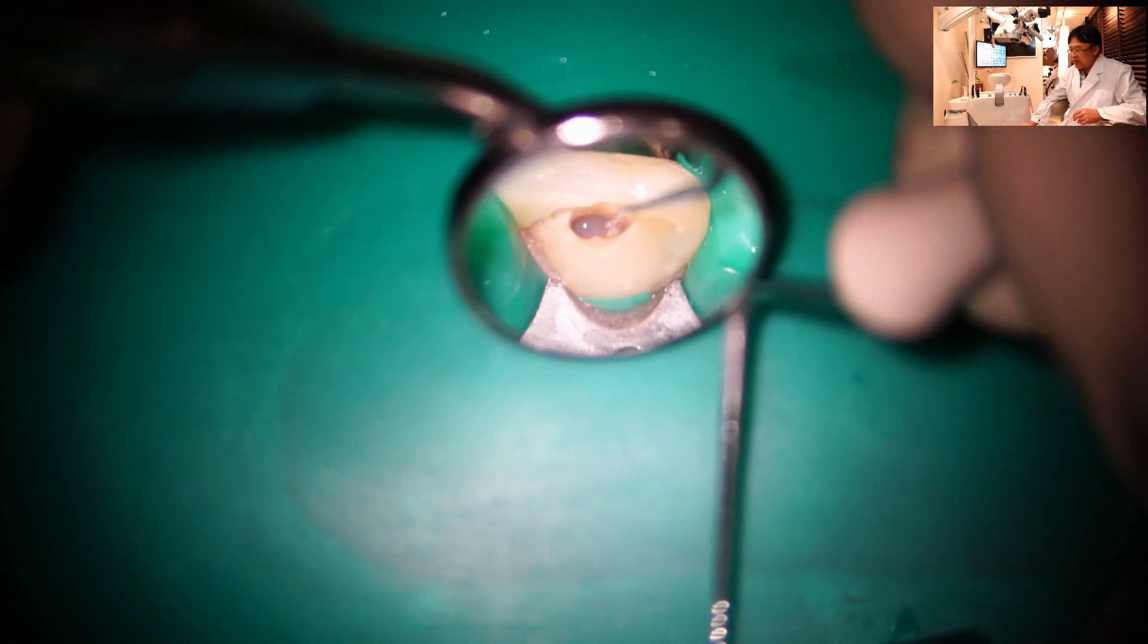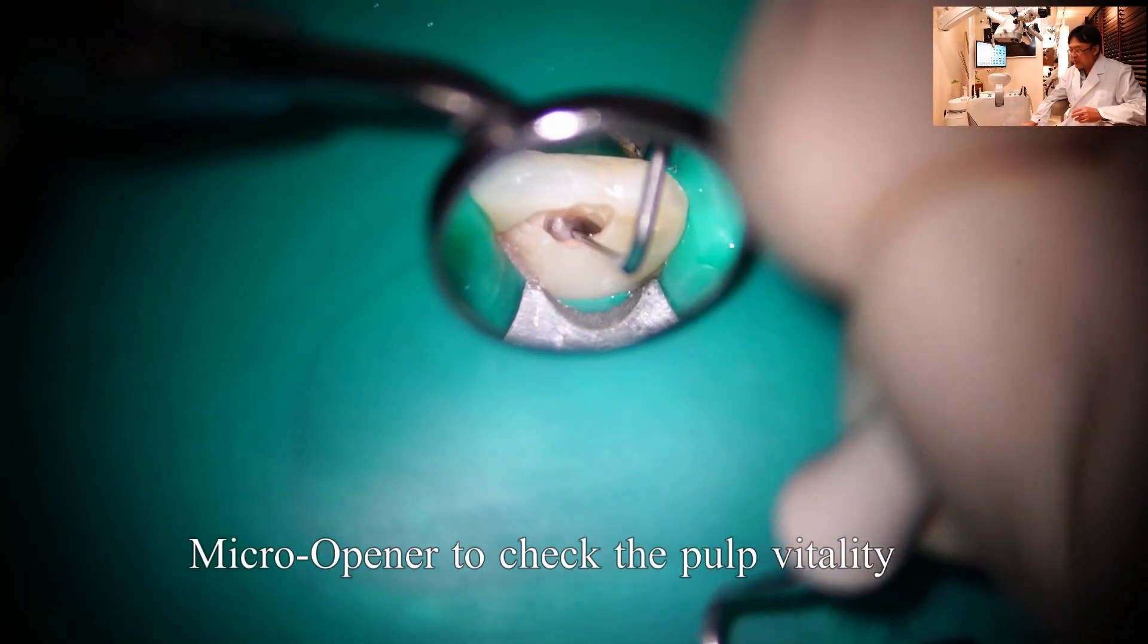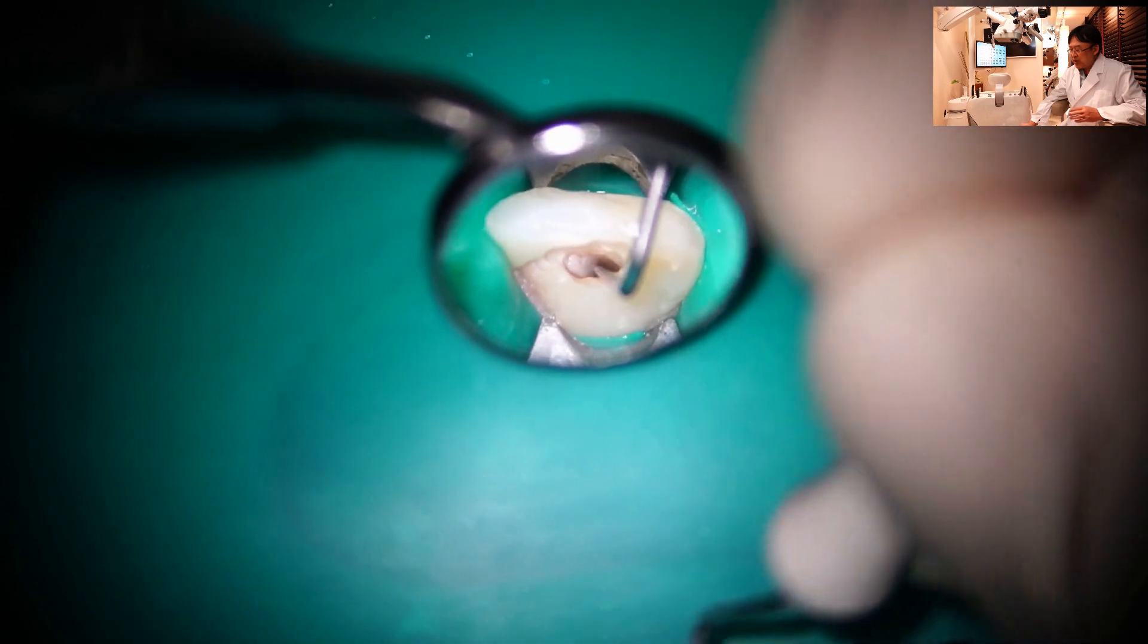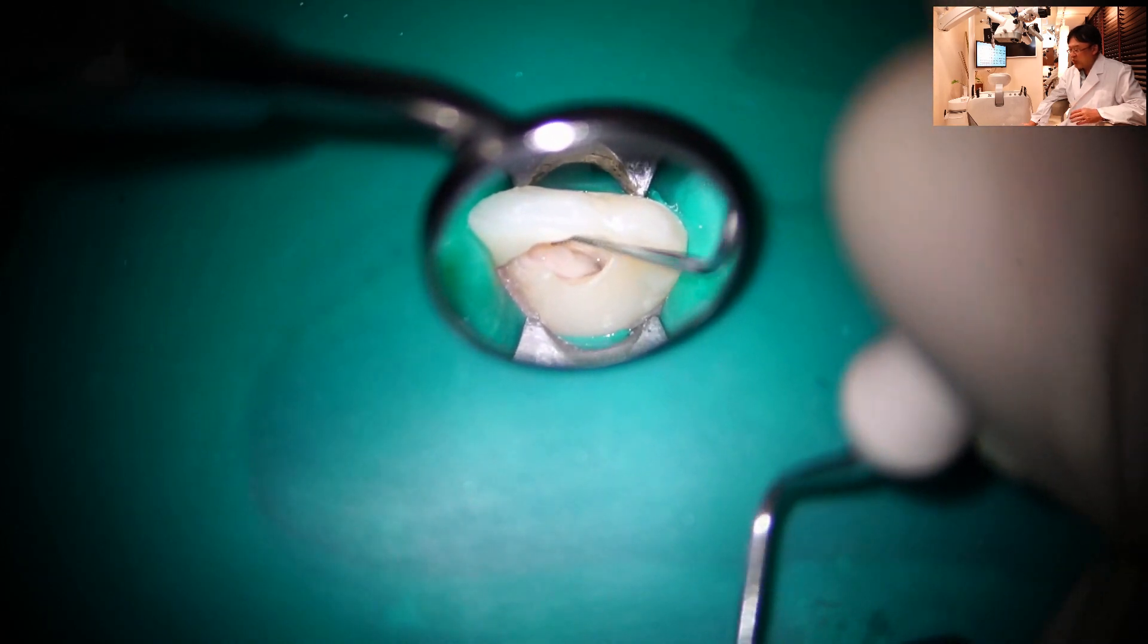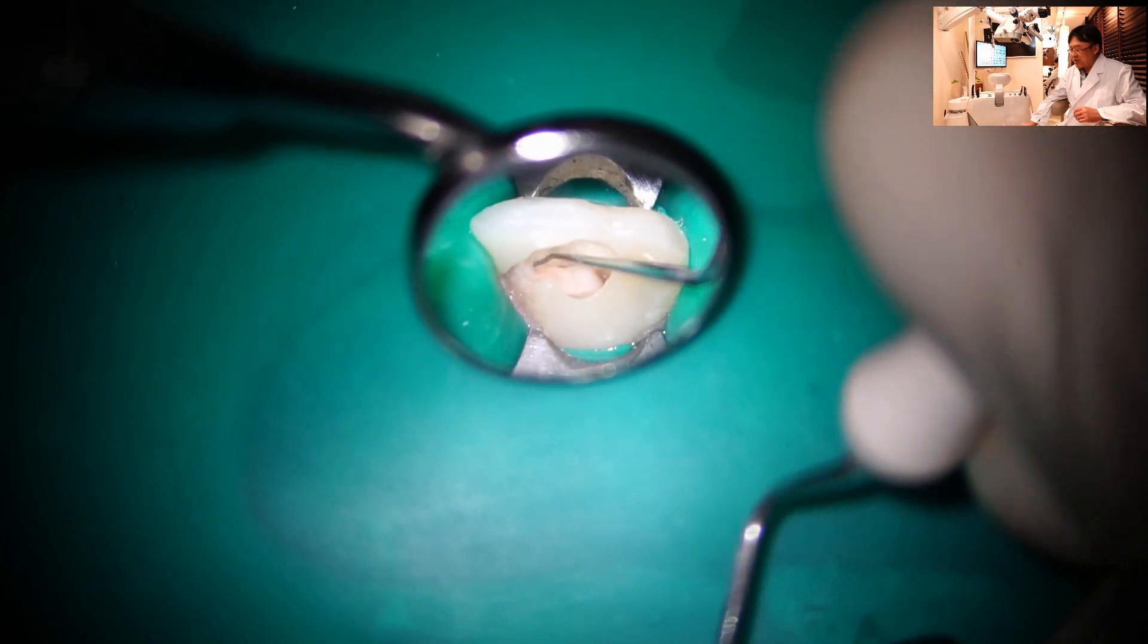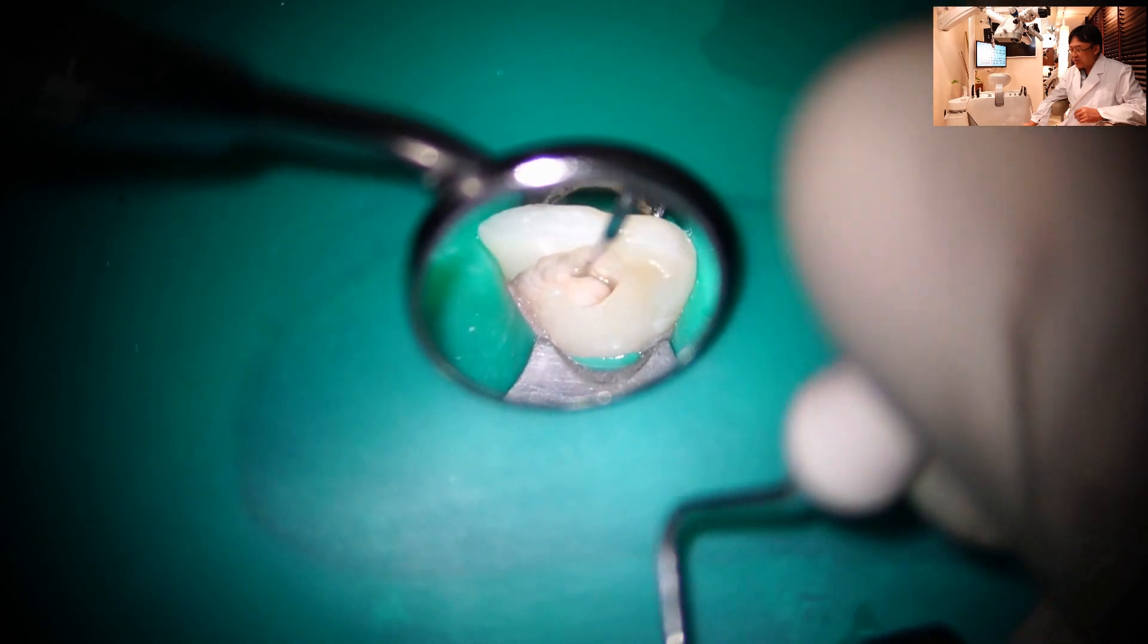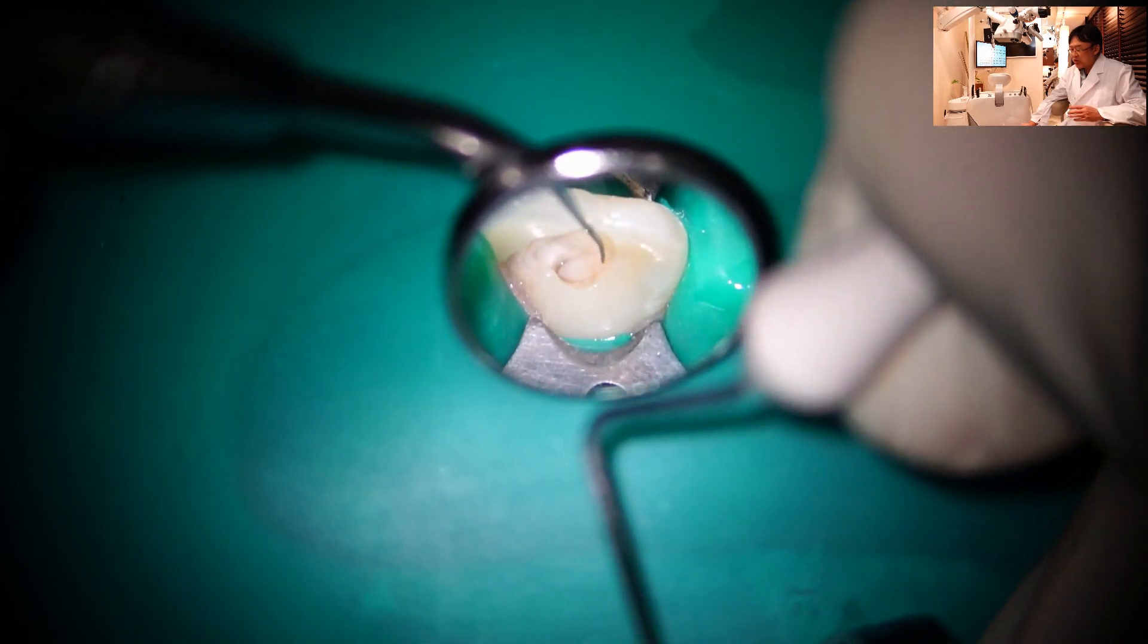Now I can see inside the tooth. There's no bleeding. So I'm checking the vitality of the tooth. It's completely necrotic. No bleeding. And the patient says there's no pain. So this means the tooth is dead.